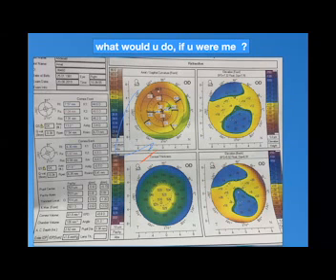So if I will go for a corrective refractive surgery, I will go for PRK. You will go for PRK, even if you have a y coordinate of -1.2? Yes, it is a point of suspicion, but the patient still has a good best corrected visual acuity.